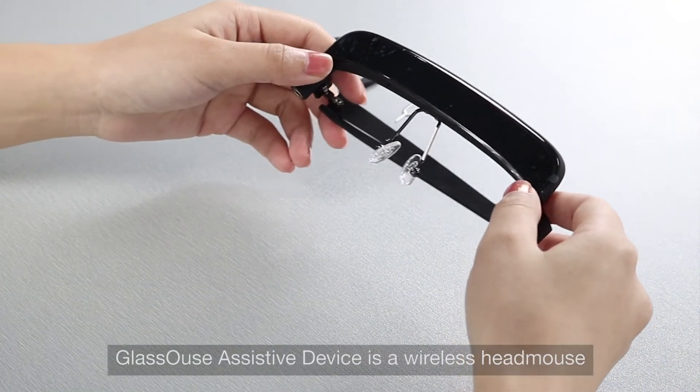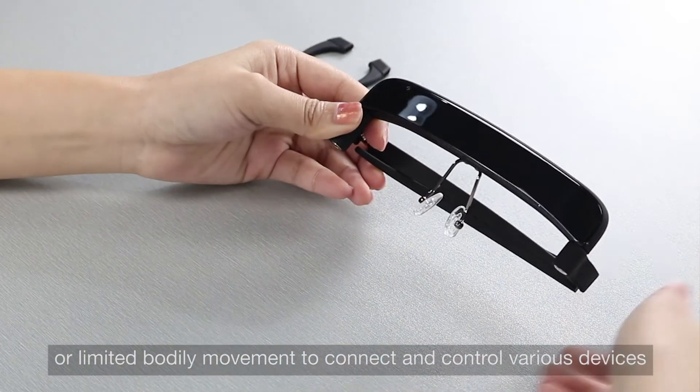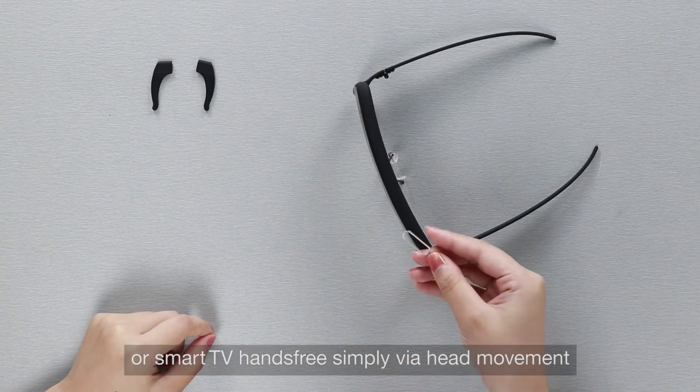GlassOuse assistive device is a wireless head mouse, allowing people with disability or limited bodily movement to connect and control various devices like mobile phone, computer, tablet, or smart TV — hands-free, simply via head movement.